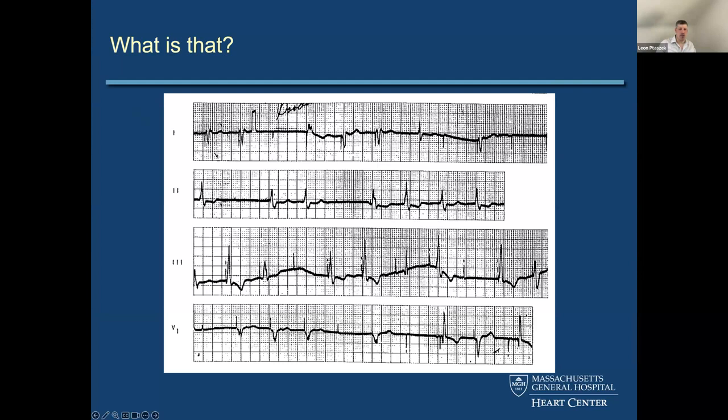So ventricular pacing, and here's a pacing spike, but nothing happened. And there's no native anything. There's no native P wave, QRS, nothing. So why did this one not capture? Well, it didn't really have an excuse to capture. As distinct from the tracings we looked at before, it's not like there's a native complex around. It's not like this is pacing within the refractory period of the ventricle. It's been a while since the last pacing spike. So when I see this kind of thing, I immediately get suspicious that it's just failure to capture. The device is doing what it's supposed to do, coming in on time. This interval between pacing spikes is the same as when it was capturing. It just didn't capture this time.